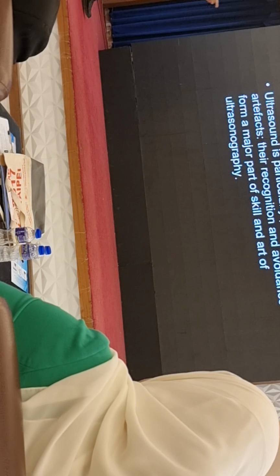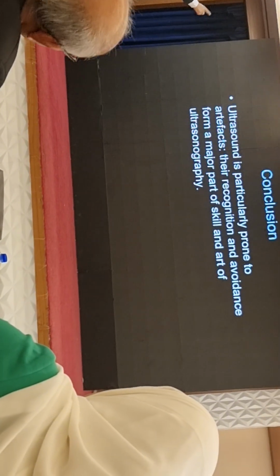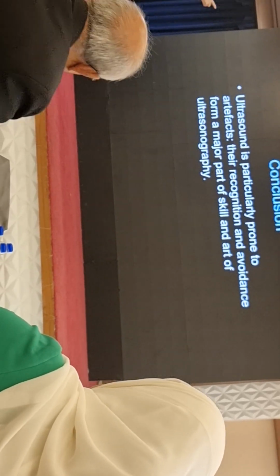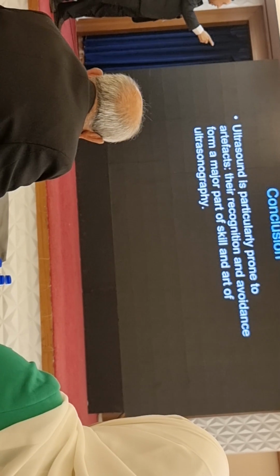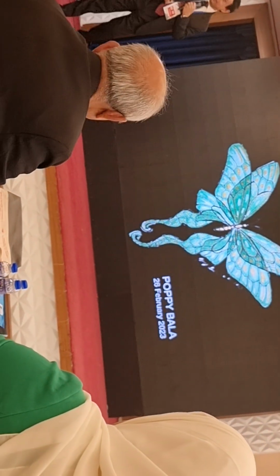In conclusion, ultrasound is particularly prone to artifacts. Their recognition and avoidance form a major part of the skill and art of ultrasound. Thank you.